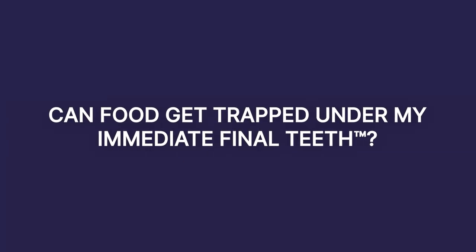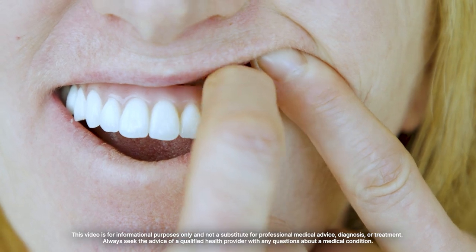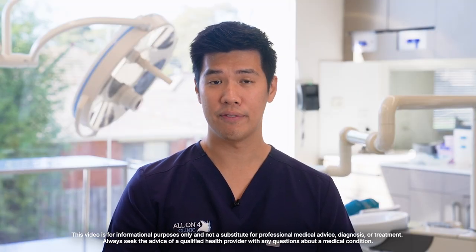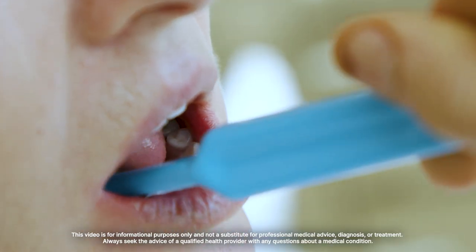In the same way food can get stuck around your natural teeth, food and bacteria can always get under the bridge, in between the gum and the bridge. Cleaning your immediate final teeth is very much like cleaning your own teeth — you have to brush around all the surfaces: the biting side, the cheek side, and the tongue side.